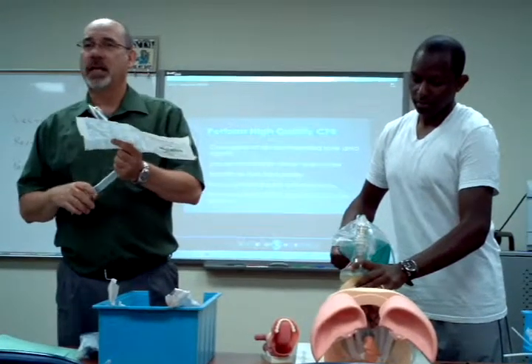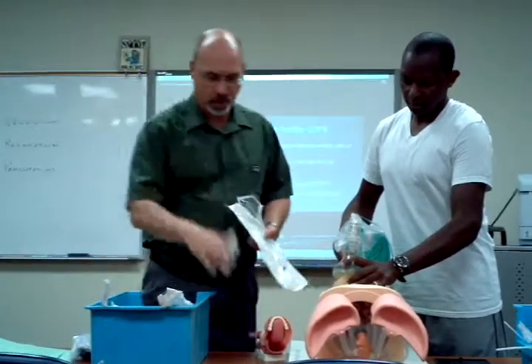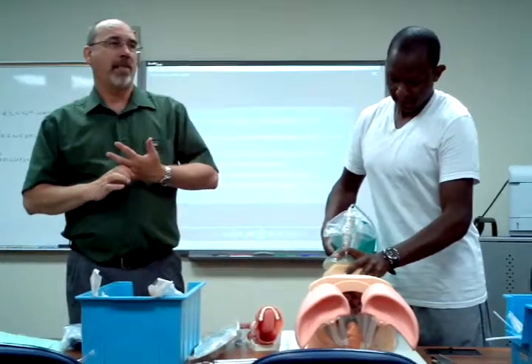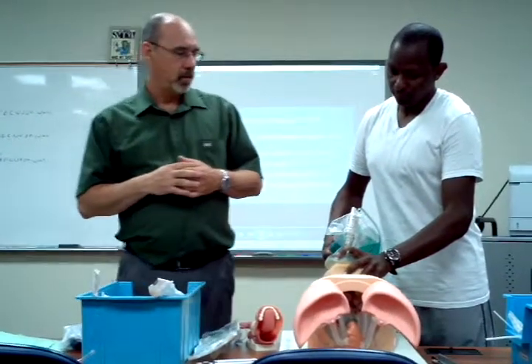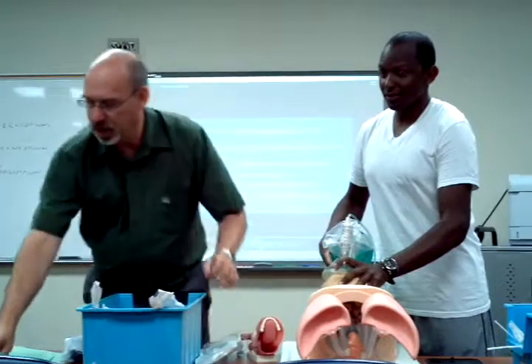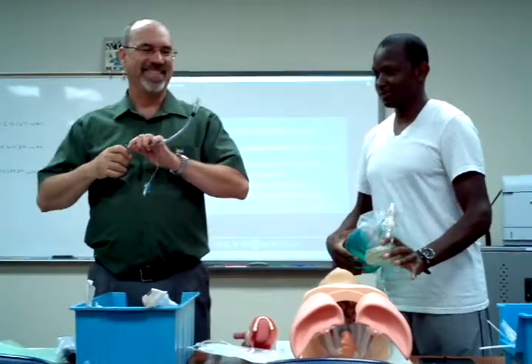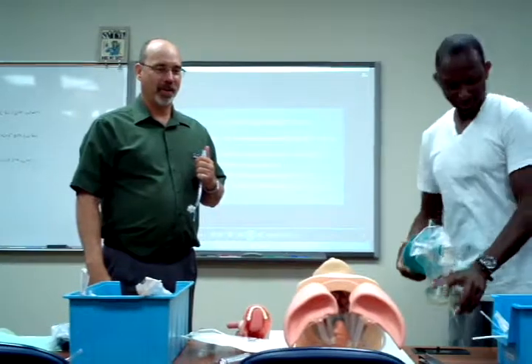I've worked with this patient for three days now and they've just steadily gone downhill. I'm going to use my syringe — that cuff looked good. Light looks good. I'm going to do a quick assessment. If I have a pulse ox available, check how they're doing. I'm going to go ahead and use a stylet. Do you have my suction ready?